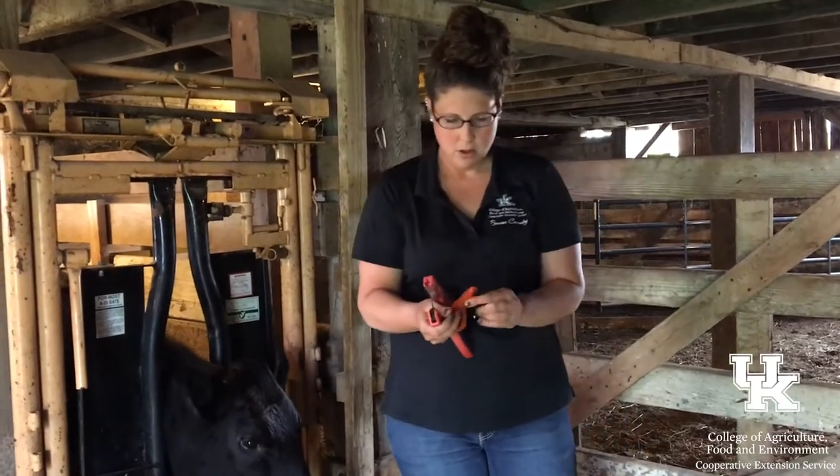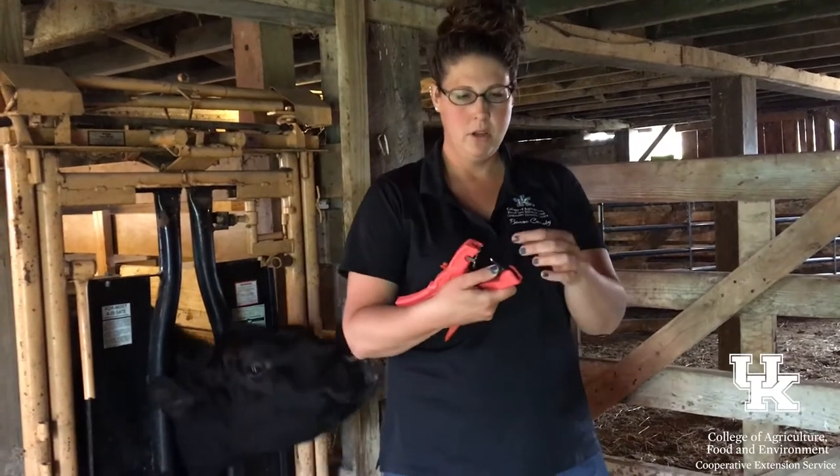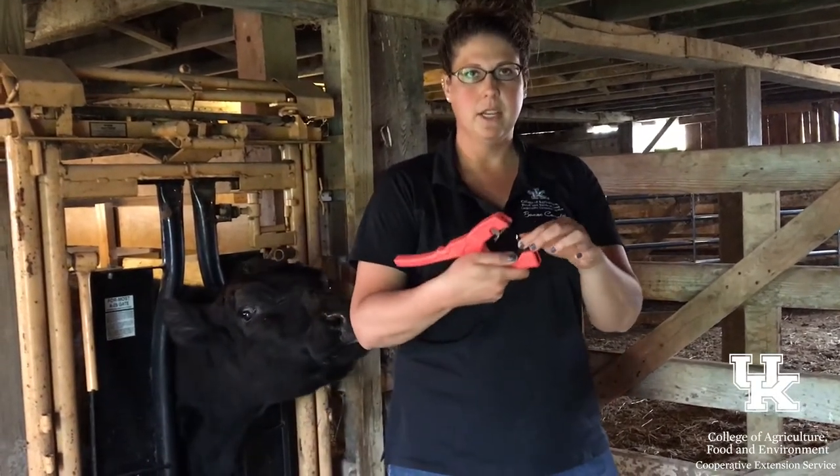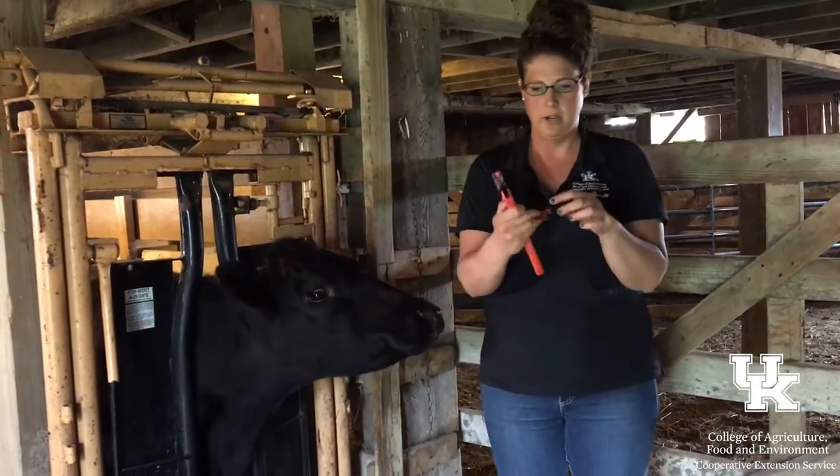This one here, the button goes over top of this little spike — it just slides right over top of it. So when the cow's ear is getting tagged, that's actually what's poking through the skin, not the tagger itself, which helps with the sanitary conditions.